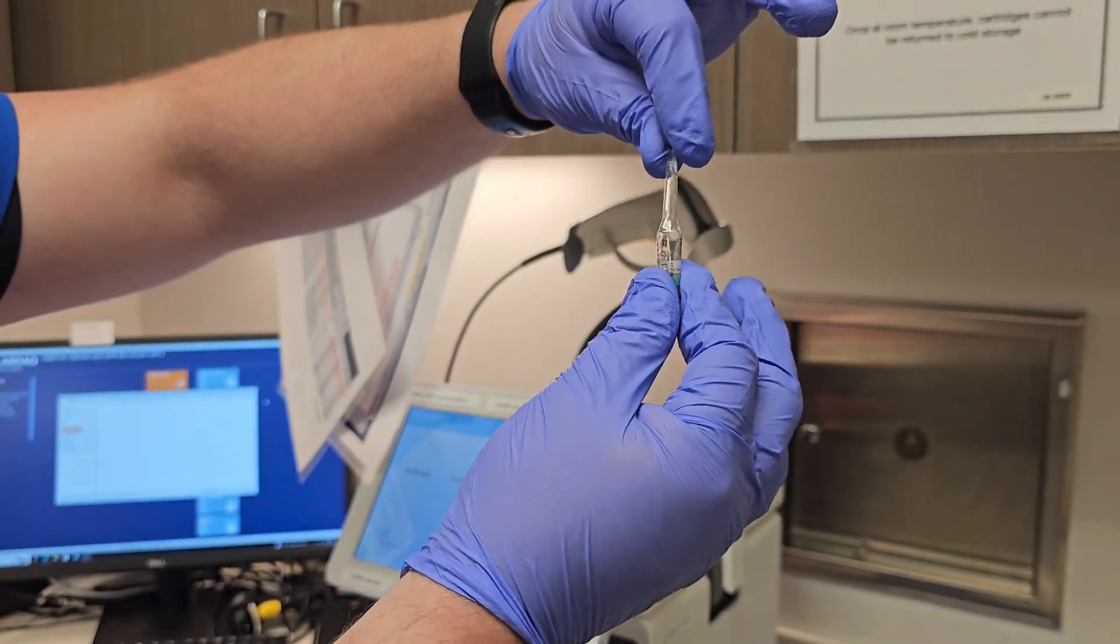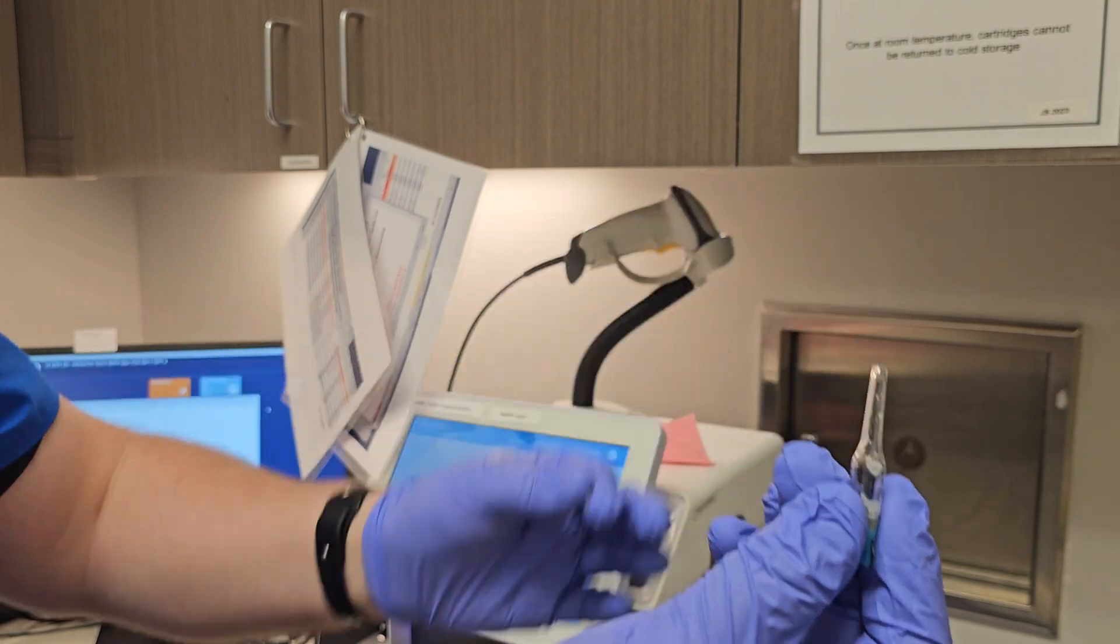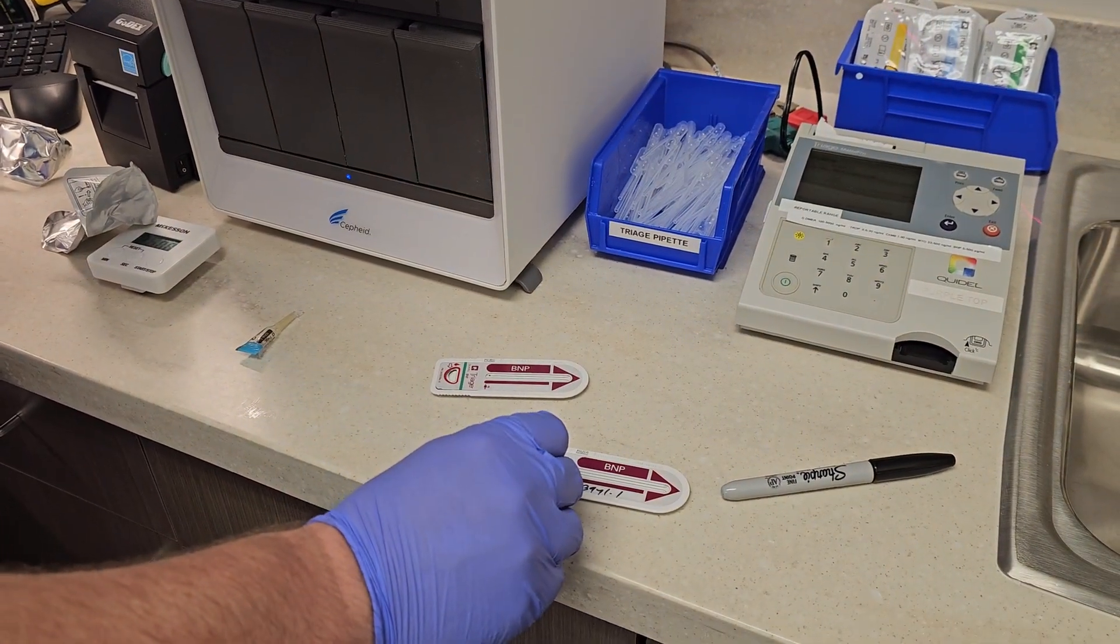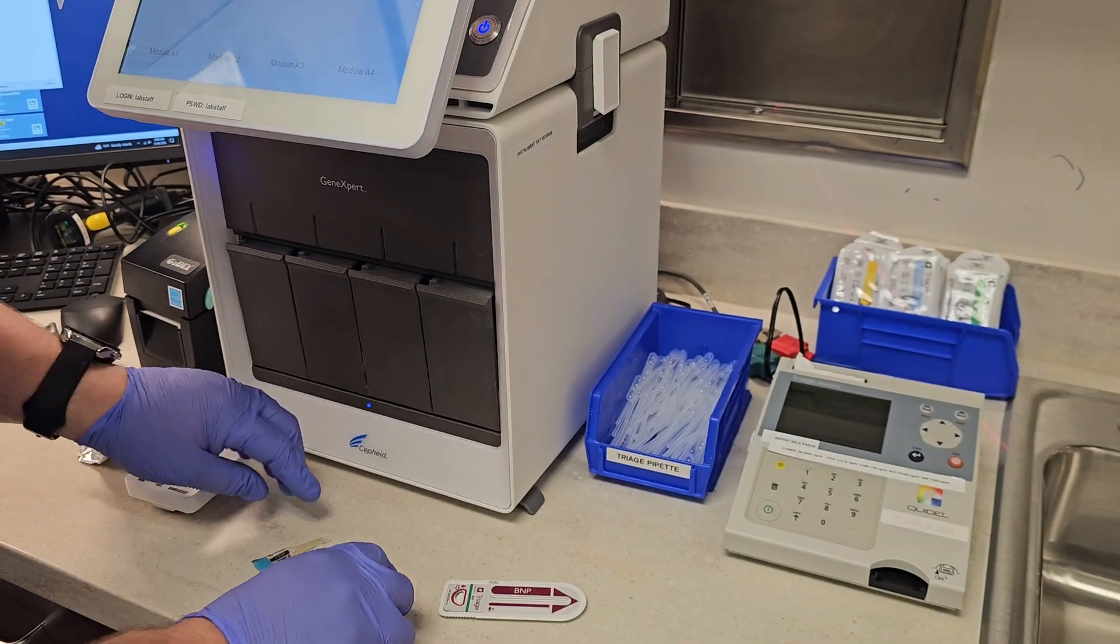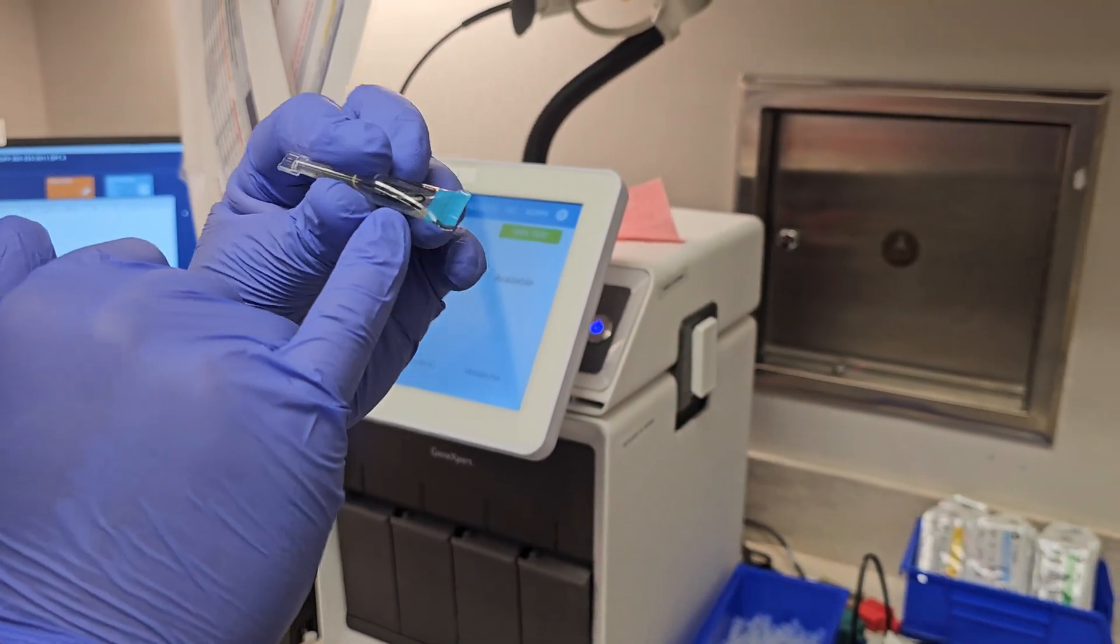Then I'm going to twist that top, come down here, and fill my sample well. That can go in the trash. Now we'll do the same process for the level two: 3976.